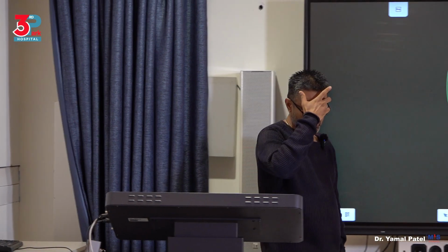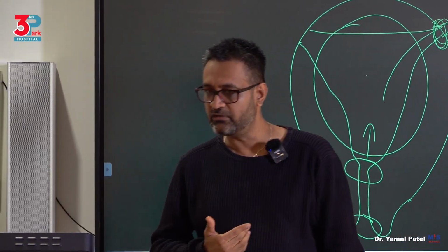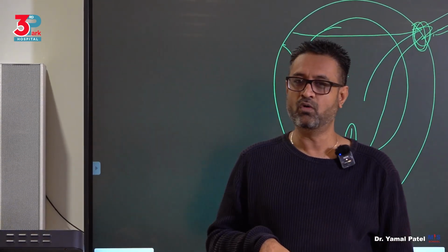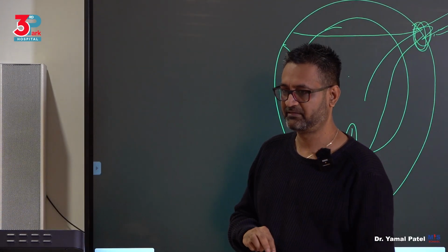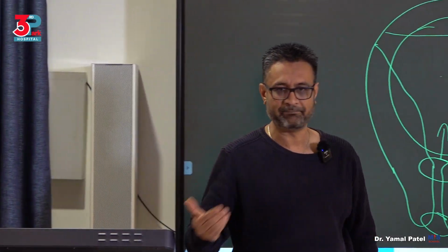And the guide we use is preferably below 100 millimeters of mercury. So put your setting max to 100, or work around the mean arterial pressure, MAP. So what is mean arterial pressure? How is mean arterial pressure calculated? Yes. So that is the calculation of the MAP.